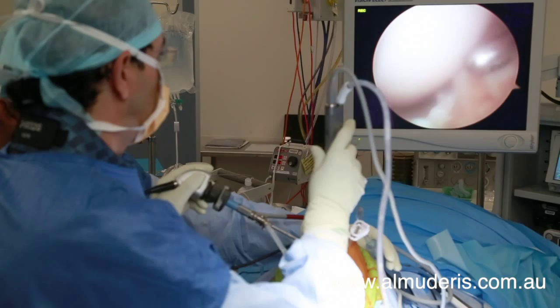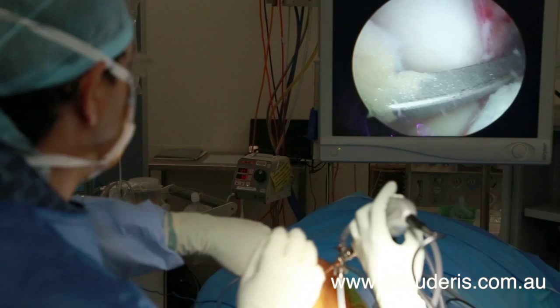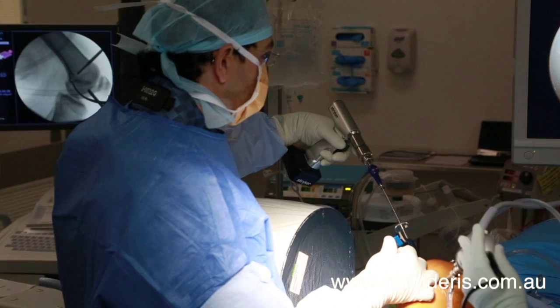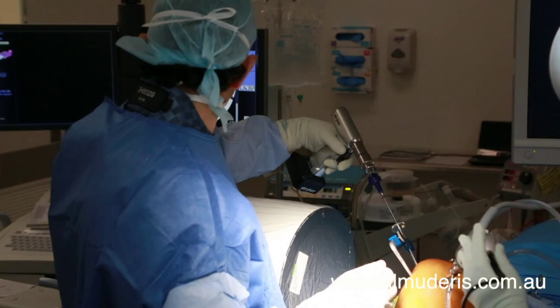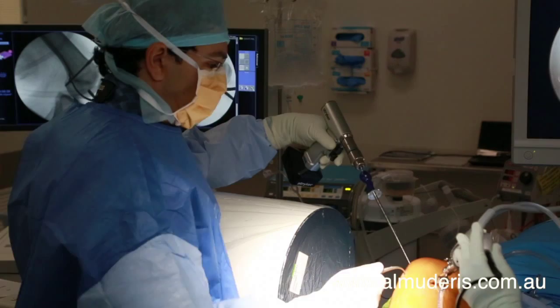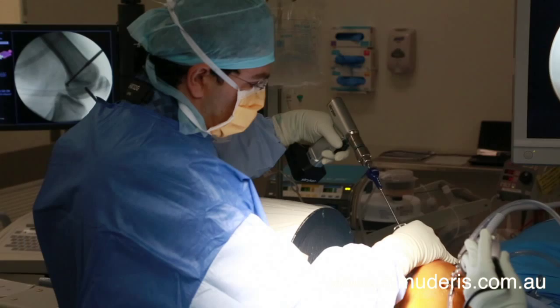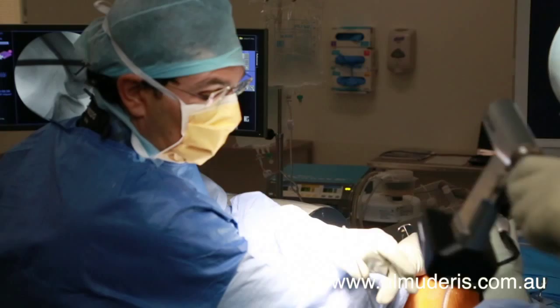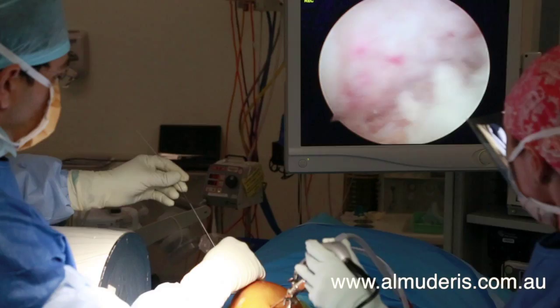The insertion point is then cleaned before a drill guide is positioned and checked under x-ray. Once in position and carefully managed, the surgeon proceeds to drill. The device at the end of the drill is known as a flip cutter, where a smaller diameter drill enters into the joint space, a cutter is flipped on the inside before drilling backwards, providing a larger diameter on the way out from the joint space.